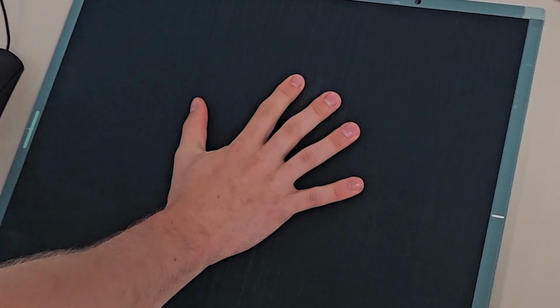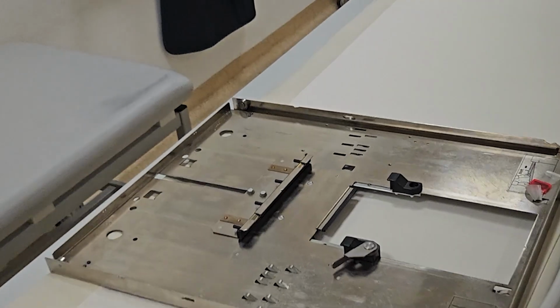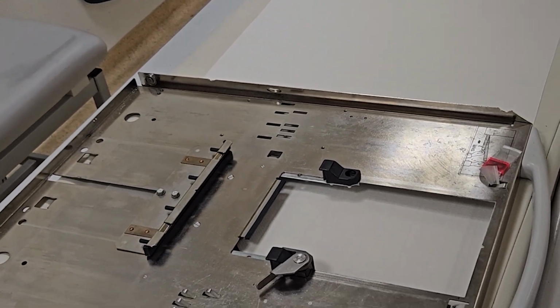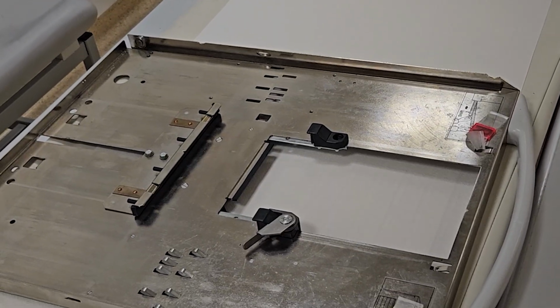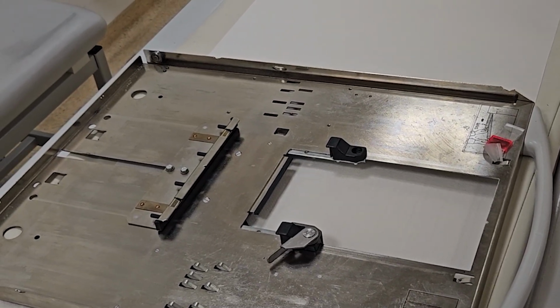Ideally, you will always want the X-ray film to be as close to the object as possible. The object casts a kind of X-ray shadow due to the absorption of X-rays by the bones and other tissues. And the further away the object is from the plate, the more blurred the shadow becomes. This is normally hardly a problem unless the patient is lying in a bed and the object to be X-rayed is the ribs, for example.